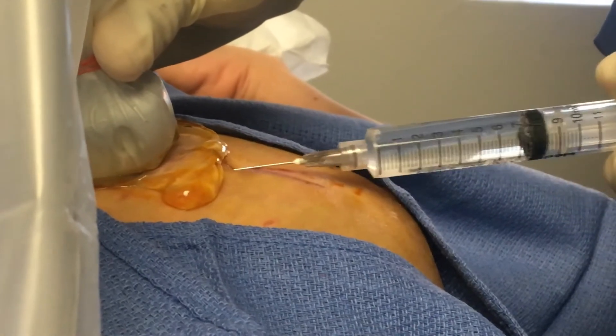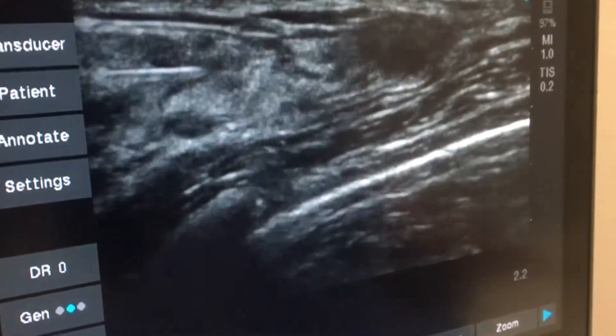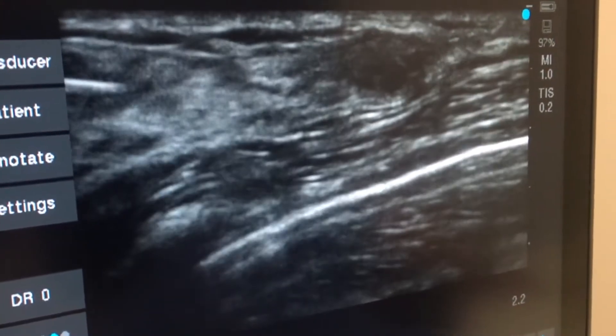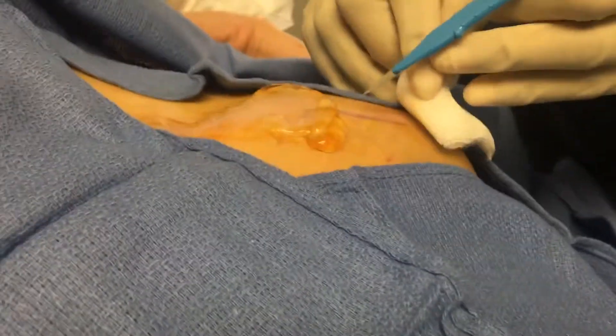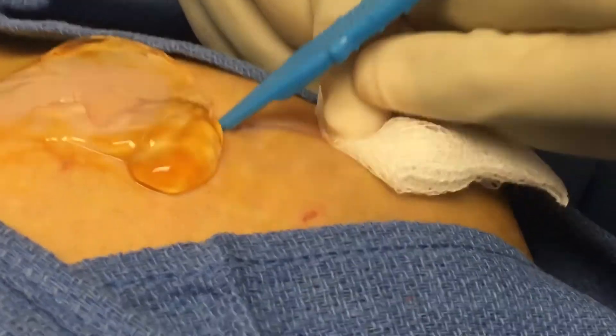The first step is to inject local anesthetic into the breast. Here's the ultrasound image with the needle appearing as a white line entering the breast on the left side of the ultrasound image. After the skin is anesthetized with lidocaine, a scalpel is used to make a small nick in the skin.